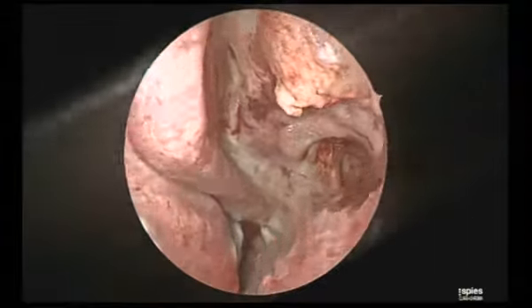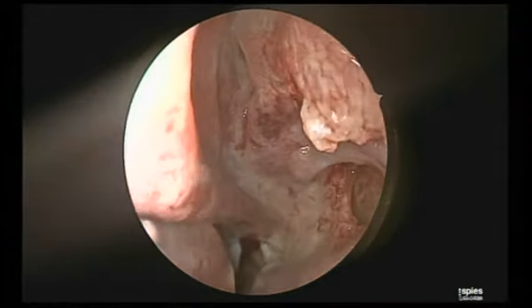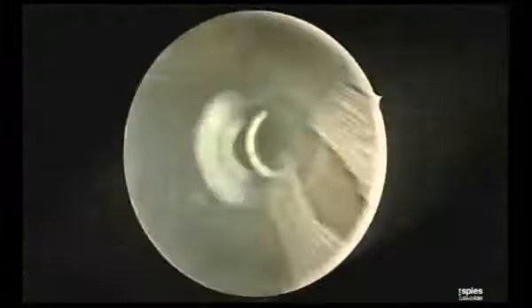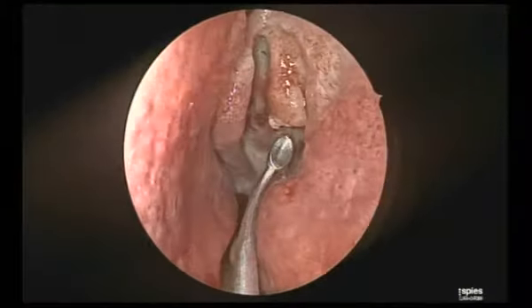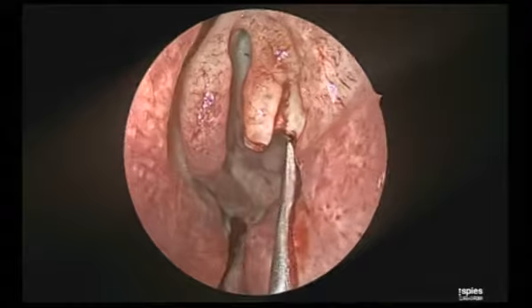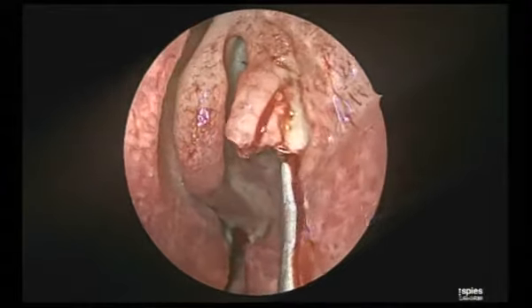So me and Ashim, we joke about you, Satish. Your fresh cadavers bleed and your patients don't bleed. I don't know. I am thankful to the anesthetist here for the preparation.